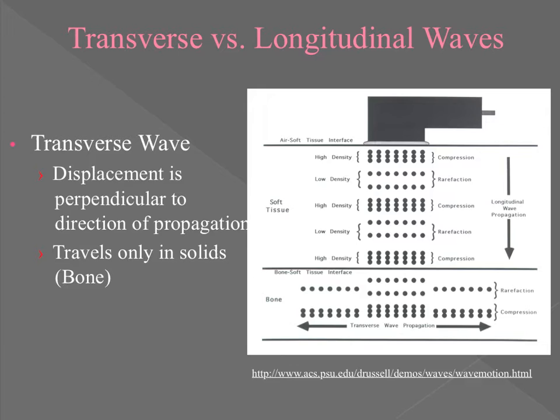The other area that we're most likely to see transverse waves is ankle injury. So when we're ultrasounding very close to the medial or lateral malleolus, and then last but not least, elbow injuries, right? So what am I saying to you? There are going to be times in an ultrasound treatment where we get transverse waves because we just can't help but to ultrasound over part of the bone, right?